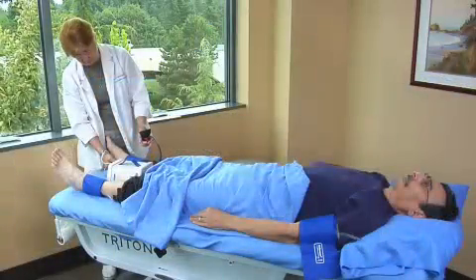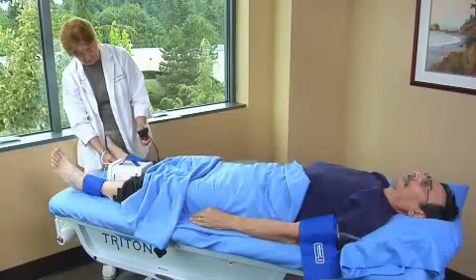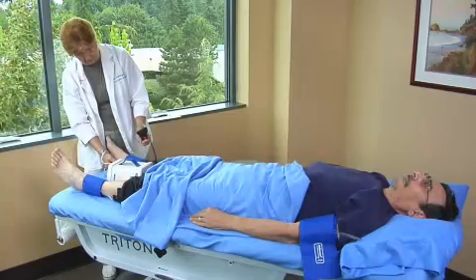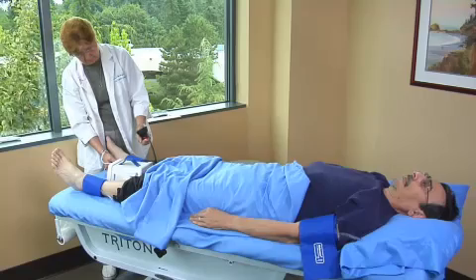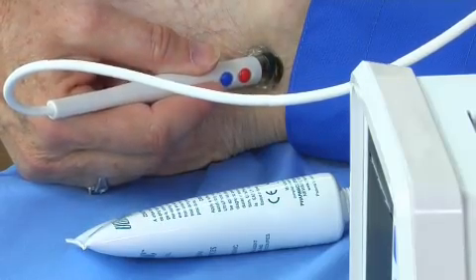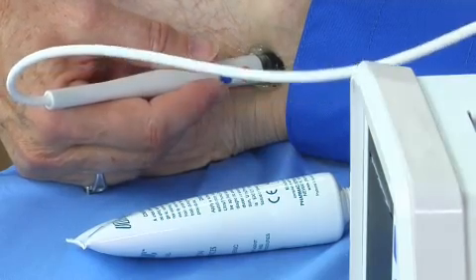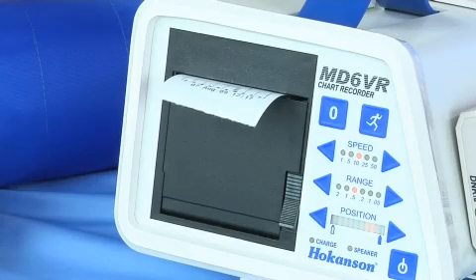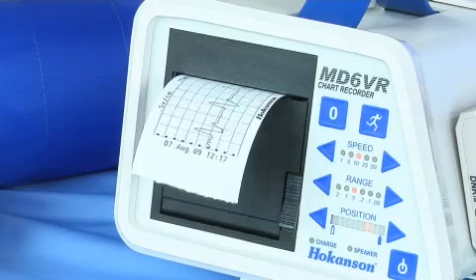The ankle pressures should be about the same or higher, although they are rarely all the same. If one ankle artery is much lower, it probably has some proximal obstruction and should be investigated. By using the highest ankle pressure, we are measuring the highest functional level of the leg. If the objective were to detect any disease that may be present, we would want to note the lowest pressure.